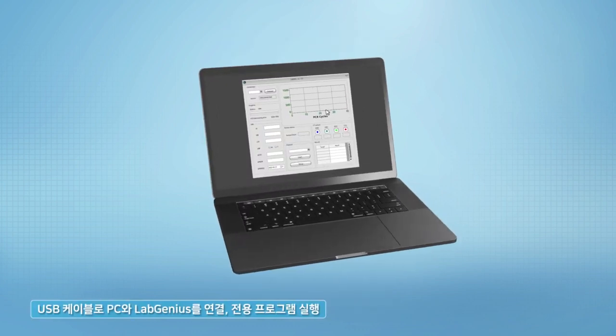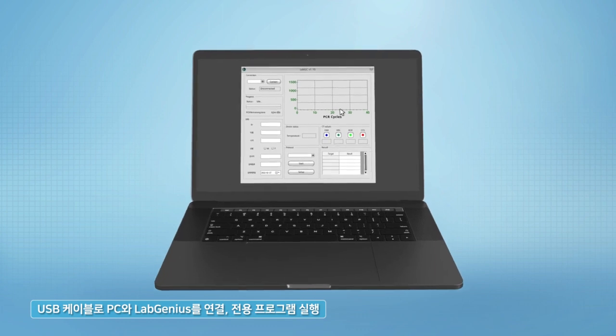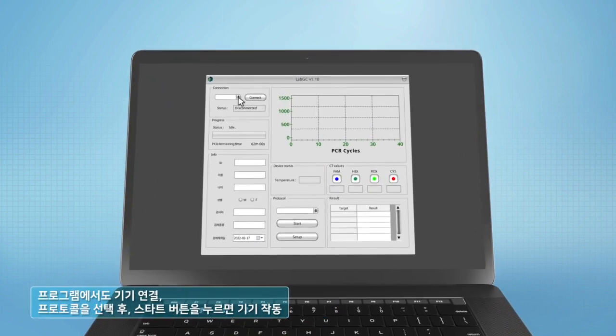Connect the PC to LabGenius with a USB cable and run the provided program. Connect the device in the program, select the protocol you wish to proceed with, and press the Start button.